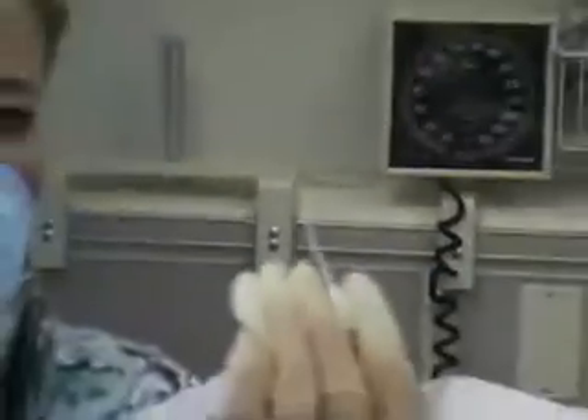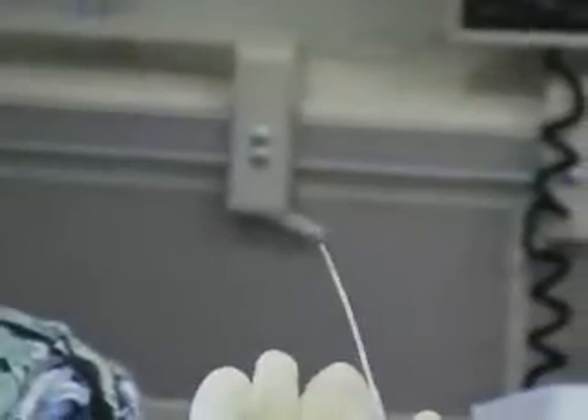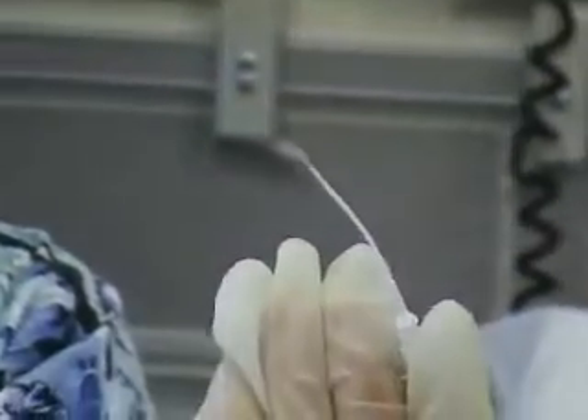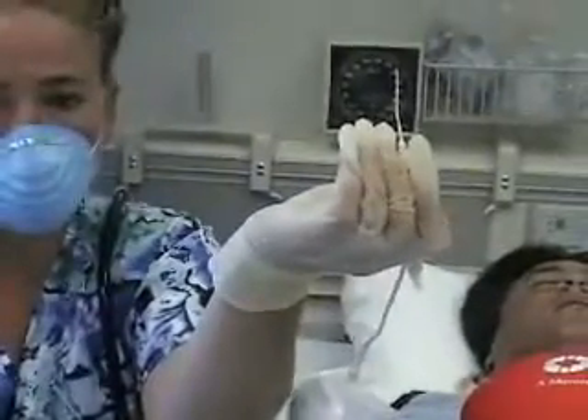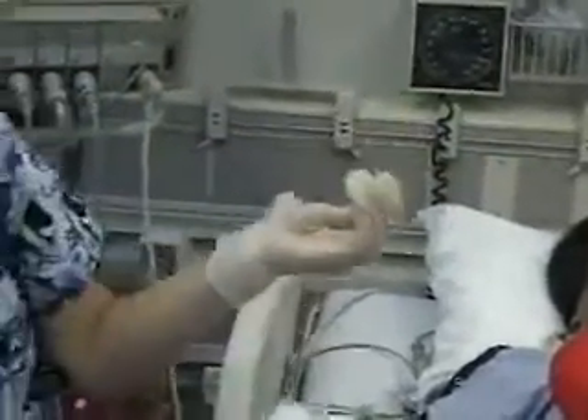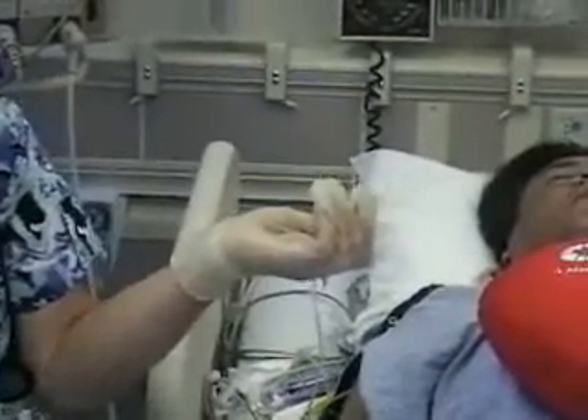Now that the stopcock is off, pull it out — one, two, three — and that's all there is to that. Let's see the catheter; we look at the tip. You always make sure that your tip is 100% intact. There shouldn't be a clot on the end as well — it should come out just as is. That goes with any of your central lines: always look at the tip and get in a natural habit of checking it.